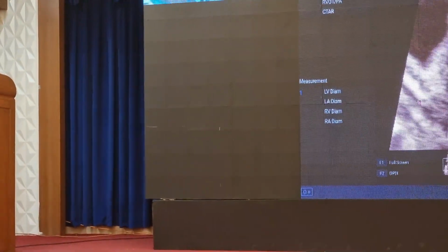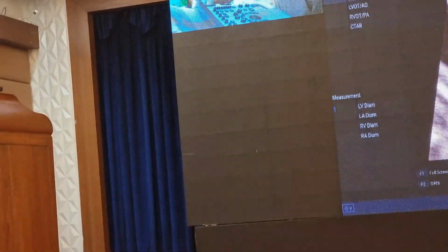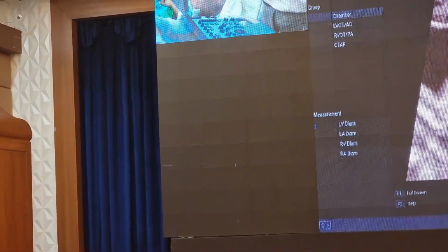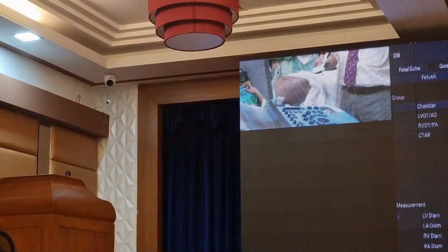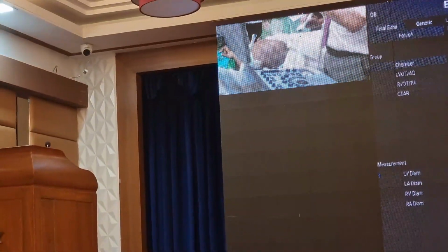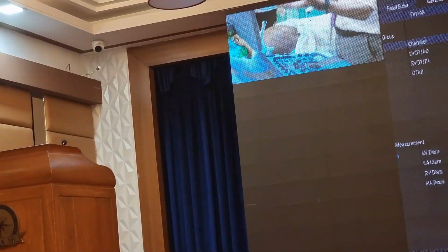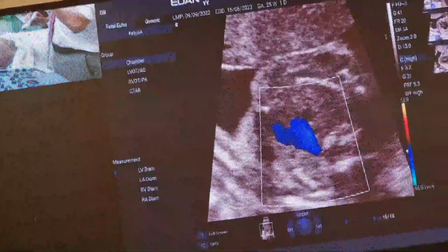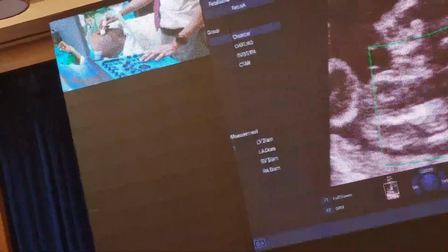When you want to screen the fetal heart for anomalies, if you have a good four-chamber view with color, and a 3VT with color, and both the views are normal and the sizes are normal, there are very good chances that the heart is normal. Therefore, in the first trimester, very often when we screen the heart, we look at four-chamber, four-chamber color, 3VT, and 3VT color. By and large, you are ruling out almost all cardiac anomalies. That's an excellent view to screen for fetal hearts.